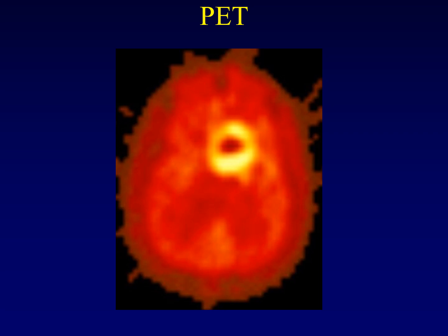Our next modality is positron emission tomography, or PET. This comes from a family of modalities known as nuclear medicine, in which we take analogs of molecules that are normally used physiologically and make them radioactive so that we can detect them. For example, in positron emission tomography, instead of glucose, we replace that with fluorodeoxyglucose. Fluorodeoxyglucose undergoes radioactive decay, gives off positrons, which annihilate with electrons. Remember, positrons are antimatter, so they annihilate with electrons, and they produce high energy photons, which we measure, and it tells us where the glucose is accumulating.